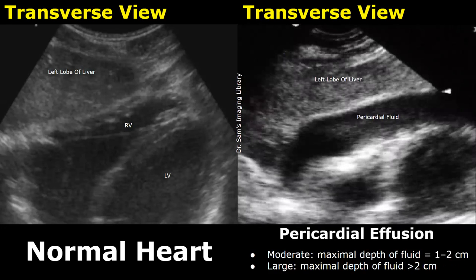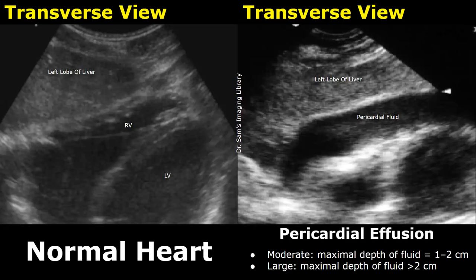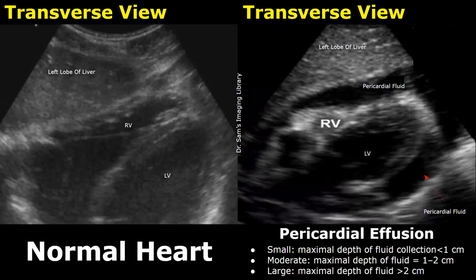In this case of pericardial effusion, the amount of fluid is more. A moderate pericardial effusion has a maximal depth of fluid between one to two centimeters, and a large pericardial effusion has a maximal depth of more than two centimeters. Here is another image of a pericardial effusion where we can see a significant amount of anechoic fluid surrounding the heart.